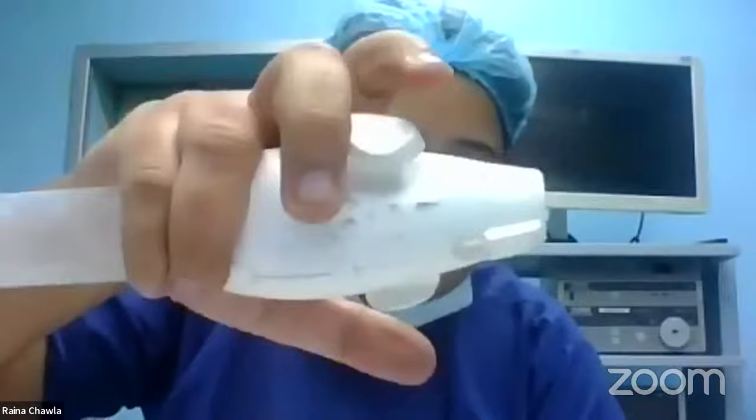Once it is full, you can just detach it, empty the products, and then again recreate the pressure, and then do it again. So you can do it as many times as required.